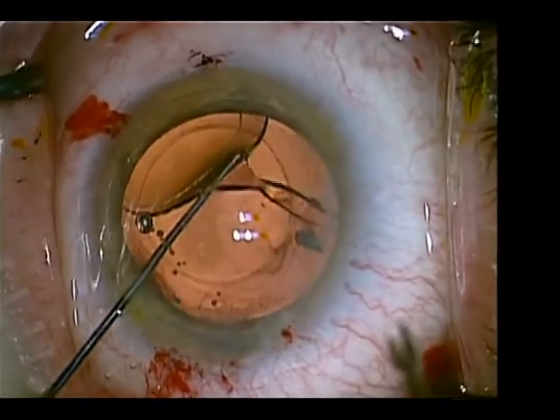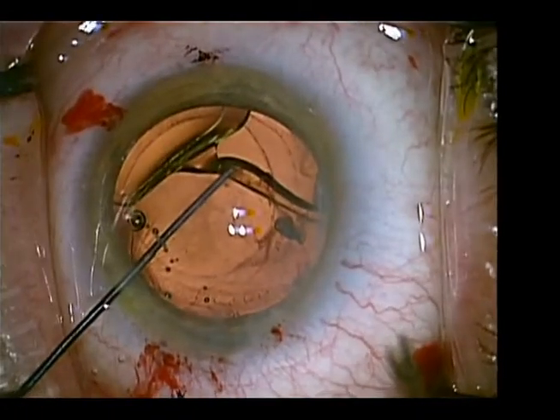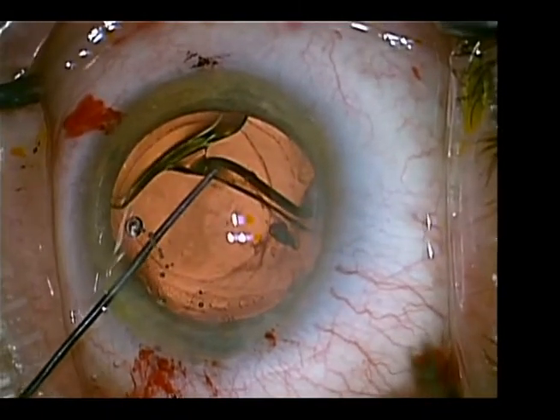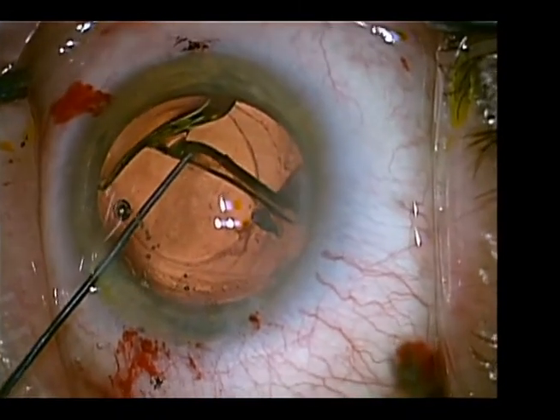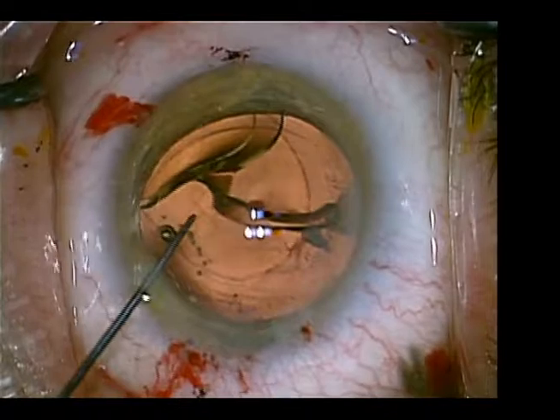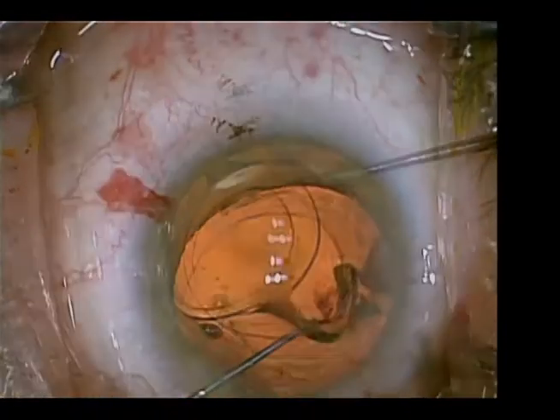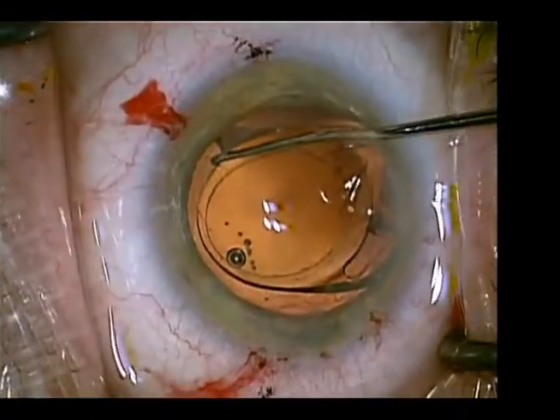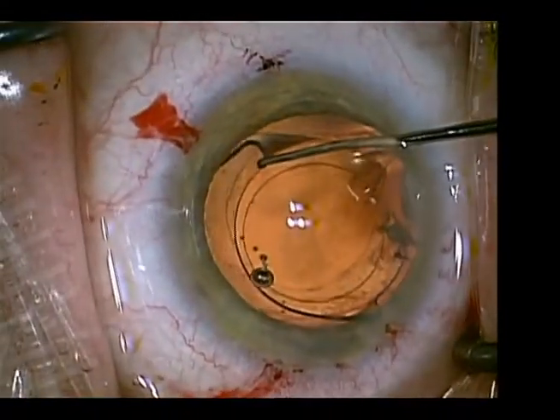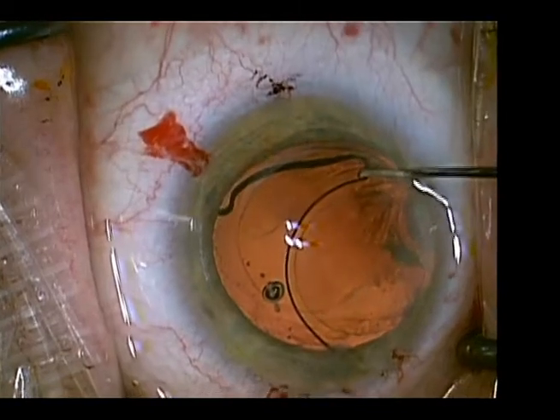As one can note, the attachments to the capsule bag are rather tenacious, but with careful and gentle blunt dissection and visco-dissection, eventually the loop is freed from the capsule fornix.